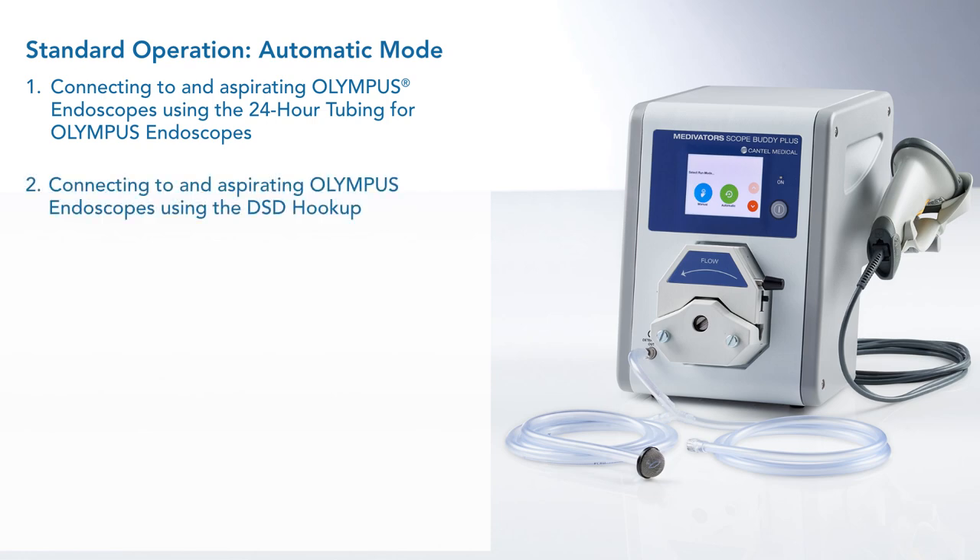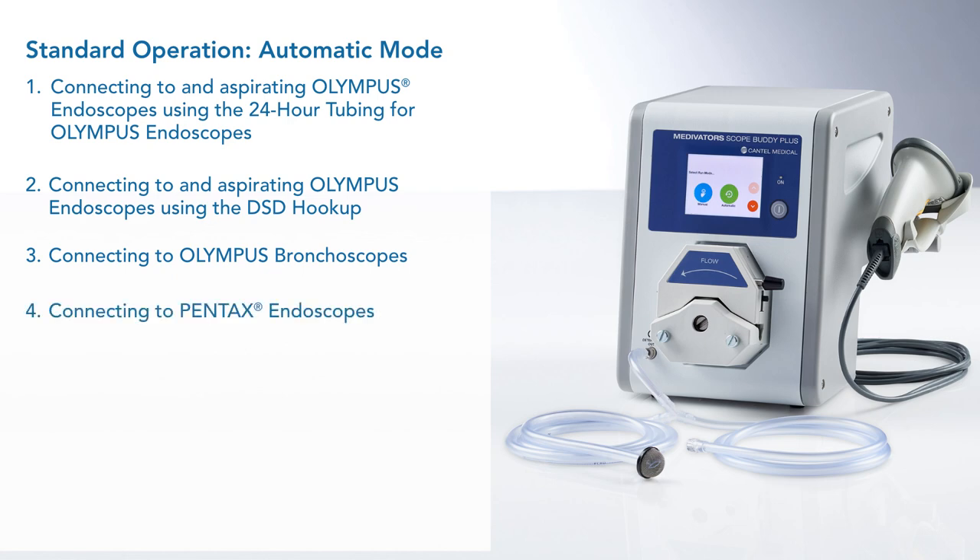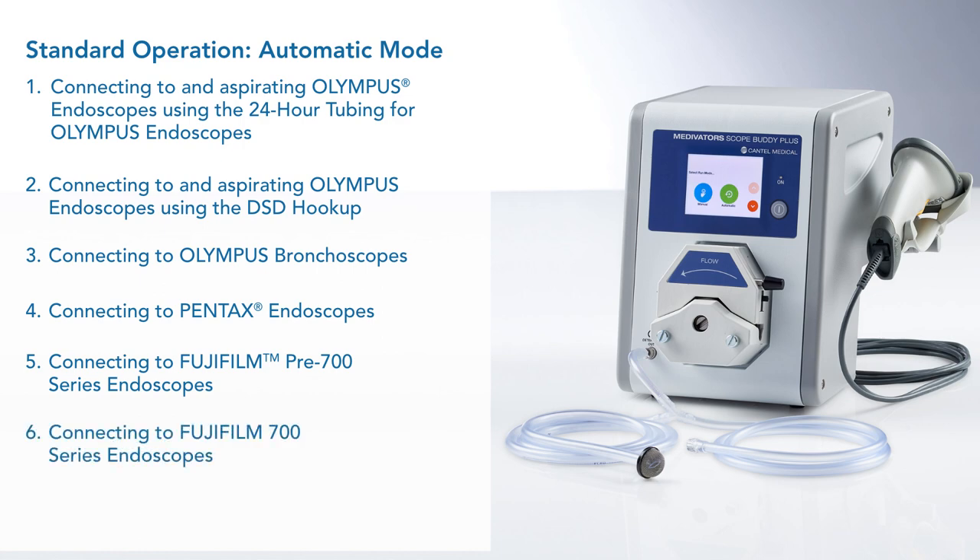Then we will demonstrate an Olympus DSD hookup. In the third section, we will demonstrate how to attach an Olympus bronchoscope to the pump tube. Section four describes how to hook up Pentax endoscopes using both the 24-hour tubing for Pentax endoscopes and the 24-hour tubing adapter for DSD hookup. Section five demonstrates Fujifilm pre-700 series endoscopes; section six demonstrates Fujifilm 700 series endoscopes. Dosing to the sink only will be explained in section seven.